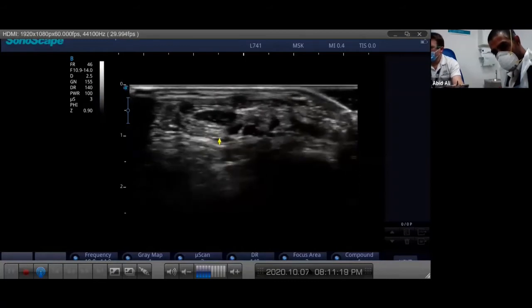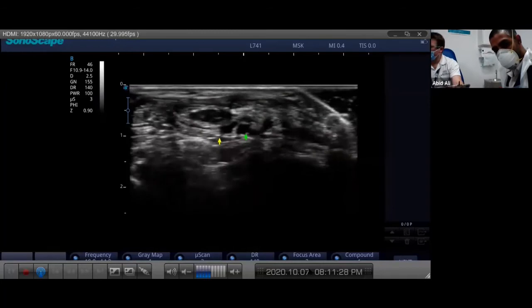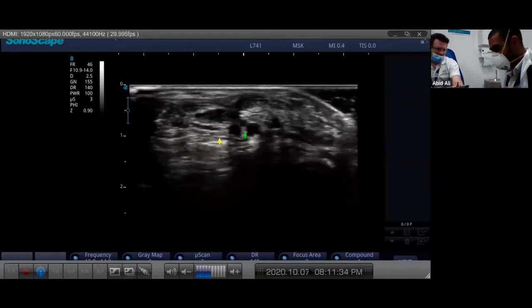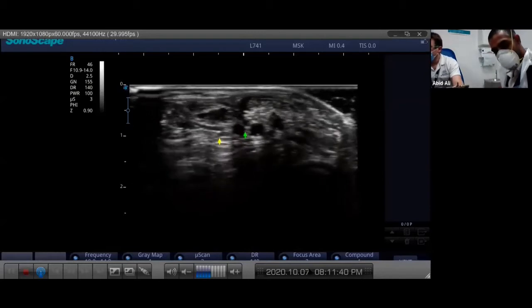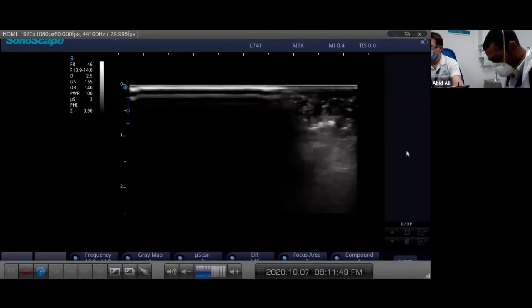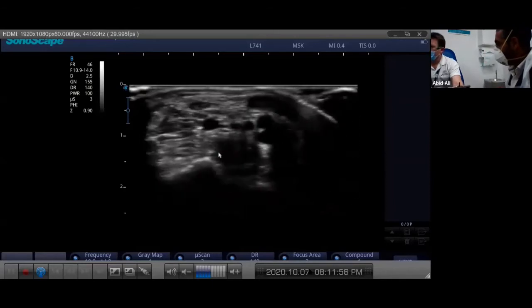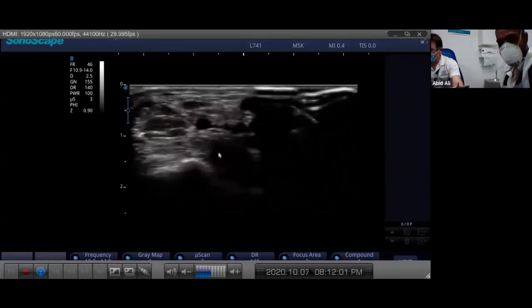Sometimes when we do injections it's quite nice to be able to press around and palpate exactly where you are in real time. So you can see now my finger is really central right over that complex. You can even make a little indentation there with your nail and you've got your anatomical marking. Sometimes if you haven't got sterile jelly, what I call 'ultrasound assisted injection' - we just put the probe where the injection wants to go, locate and landmark exactly where our structure is.